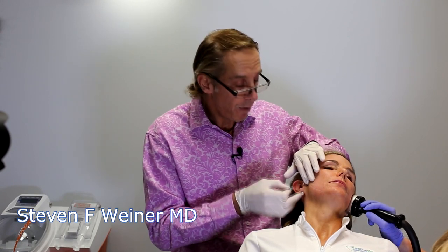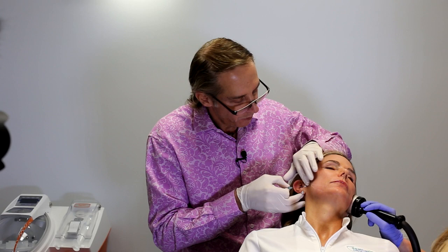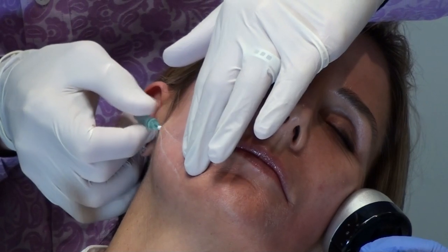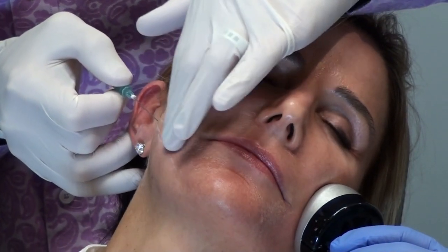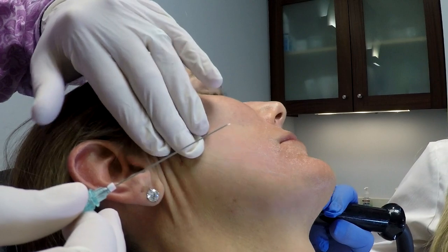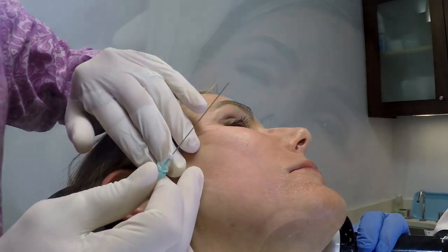So I'm actually a trainer for this as well, a national trainer. So then we go to the second one right here, and that's the second one right there. And you see, so I'm engaging the barb right like that. There's no bleeding, you see, and she's now lifted in this area. Okay, so that's the barbed threads.